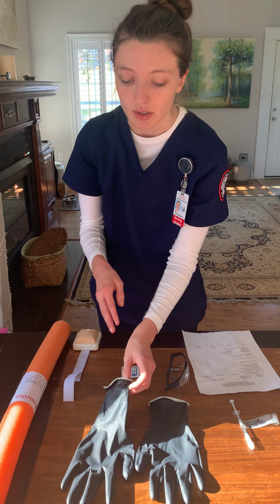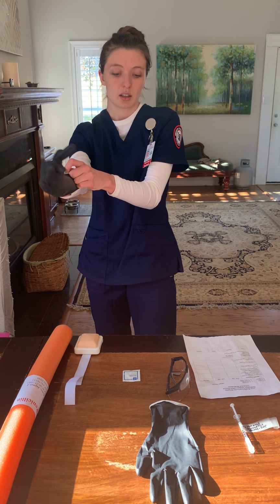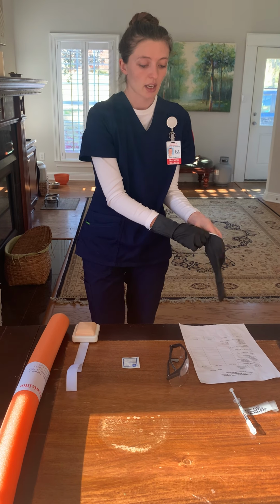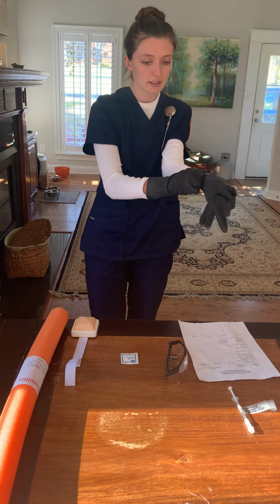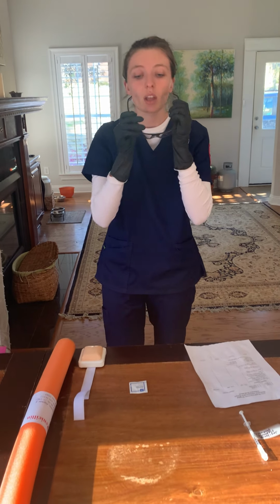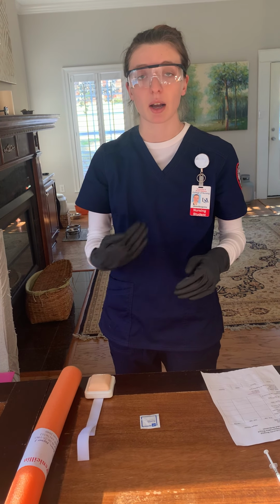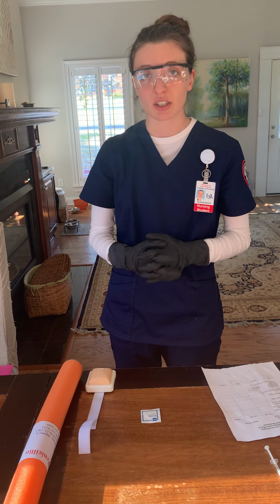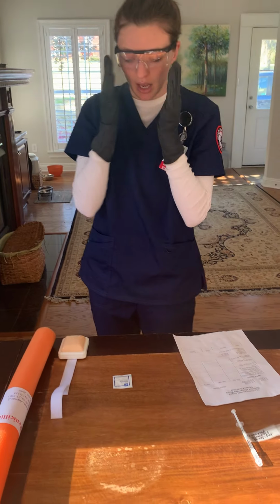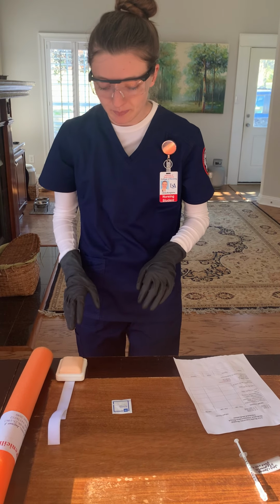I am now going to put on my gloves and my goggles. I now will assess the route. This is a subcutaneous injection. I will be using the abdominal injection area to give the heparin injection. I will be making sure that it is at least 2 inches away from the umbilicus.